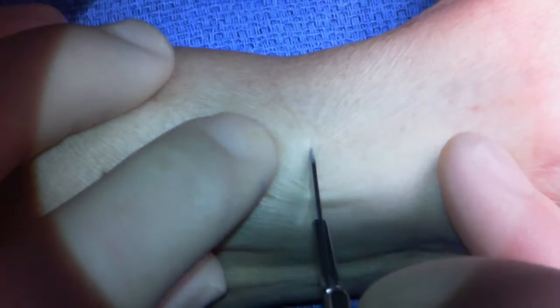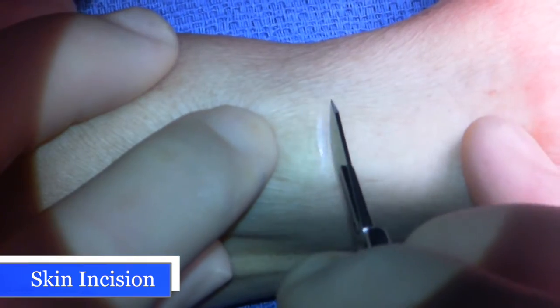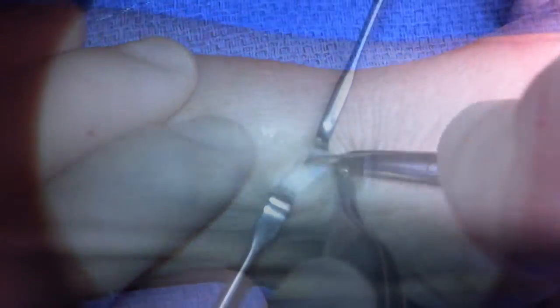DeQuervain surgery. This patient is undergoing a first dorsal compartment release. I'm going to make a transverse incision right over the first dorsal compartment.